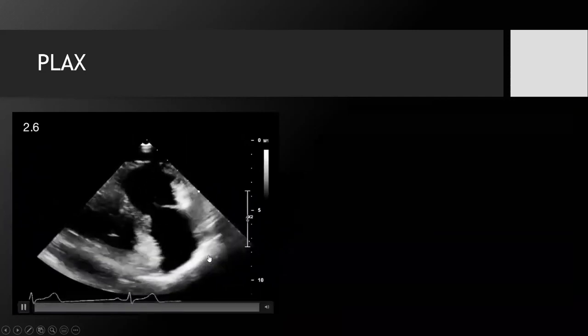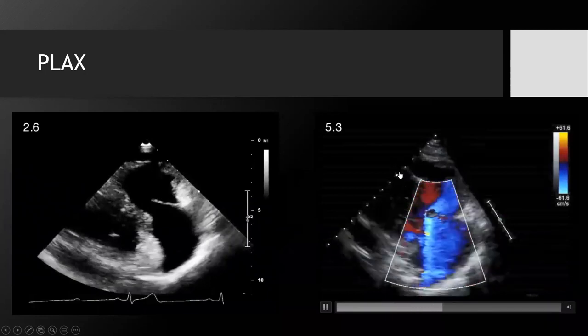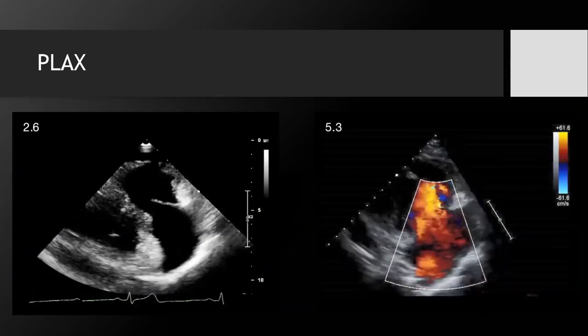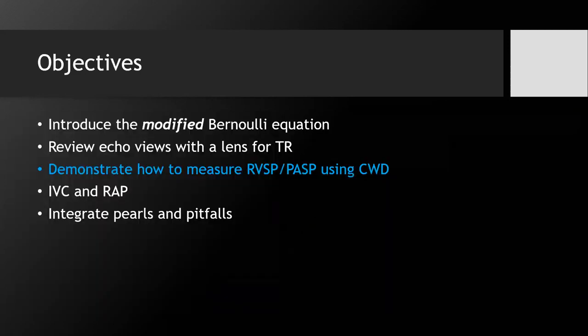Here's an example of putting color on the RV inflow view — you can get some really strong TR jets in your parasternal long axis RV inflow modified view. So you can find a TR jet in the RV inflow view off the parasternal long axis, in the parasternal short axis at the aortic valve level, in the apical four chamber, and in the subcostal. In any of those views, you can measure RVSP using continuous wave Doppler.